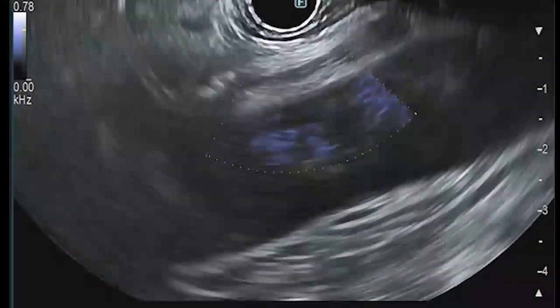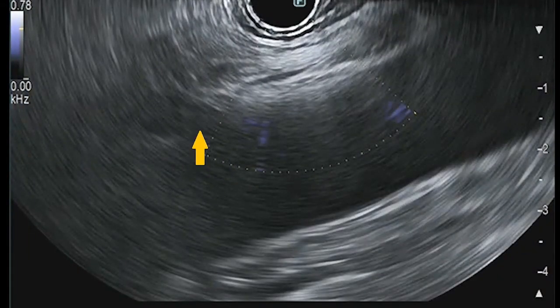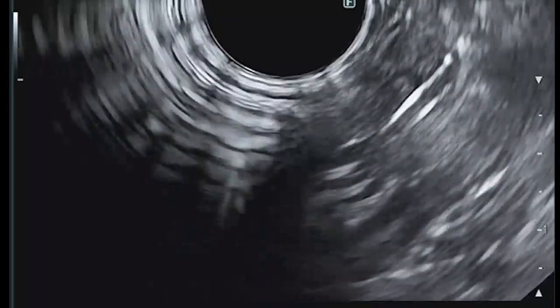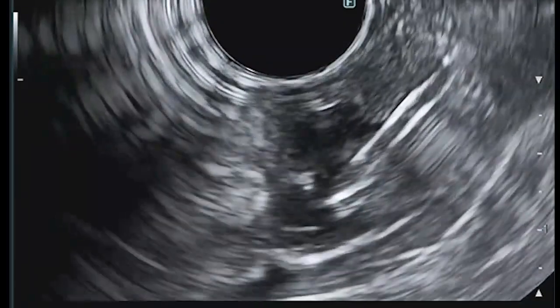that is located immediately anterior to the aorta and terminates a centimeter or two above the celiac artery origin. The level at which the right crus terminates marks the start of the abdominal cavity. Once identified, this point can be marked via EUS injection of radiocontrast or application of a hemoclip at the level of the transducer. This can then be used as a reference for the remainder of the procedure.